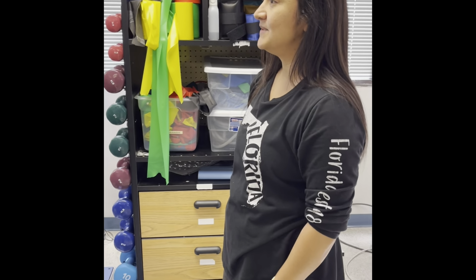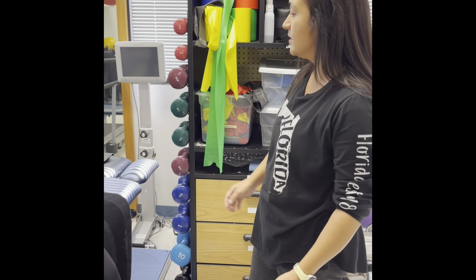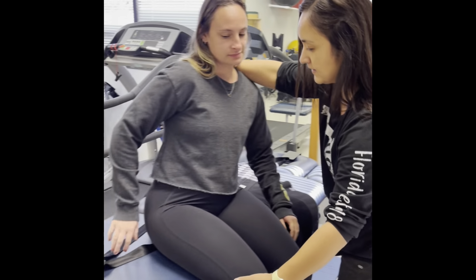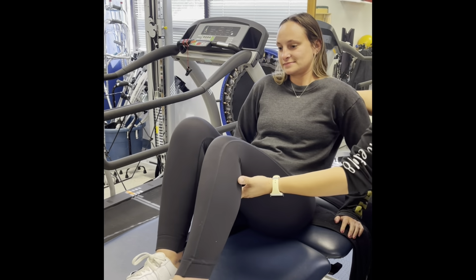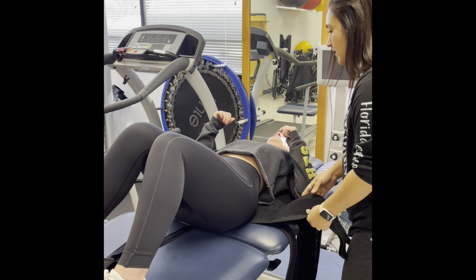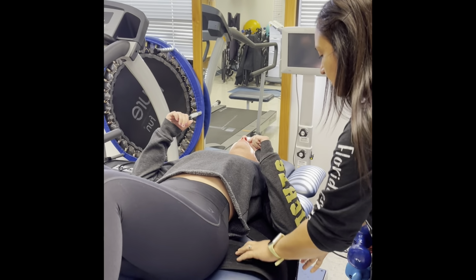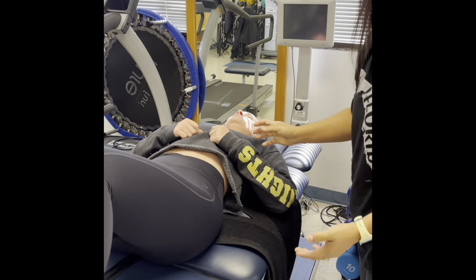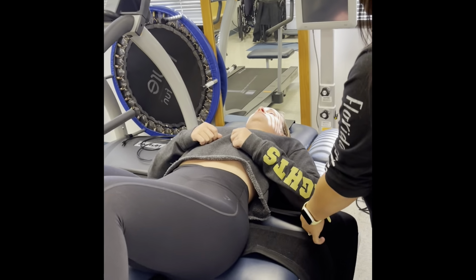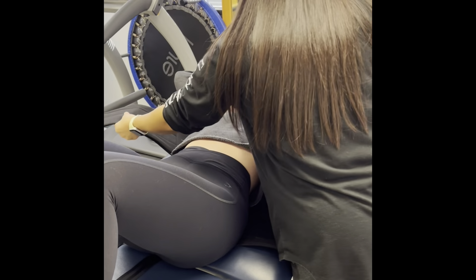Looks good. Hi Becca, I am your SPTA today and we're going to do some traction for those muscle spasms you've been having. I'm going to help you lie down here. Keep your legs together. There you go. Make sure these are right at the lumbar area. We're going to ask our patient to breathe in and then breathe out, so I'll let you know when you will be doing that for me. Let me just get these straps together here.